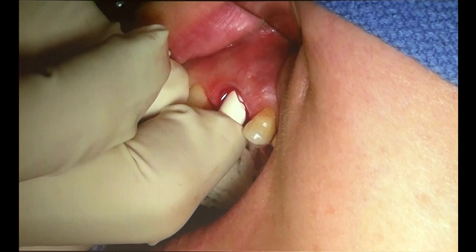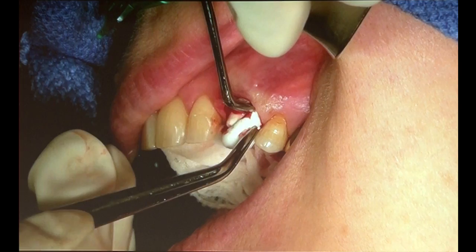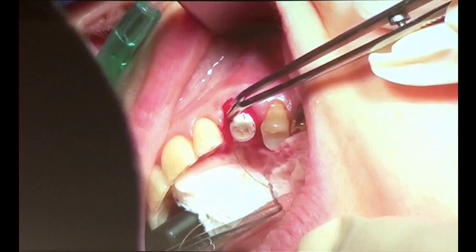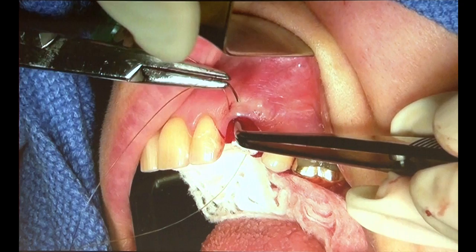So now I complete the augmentation procedure by using a collagen-based matrix, this is Colloplug, around the neck of the implant. And to avoid causing problems with the suturing for my restorative referral, I'll just throw a horizontal mattress suture on the mesial, as you can see, and then a horizontal mattress suture on the distal. That way, they'll be able to apply the provisional restoration.